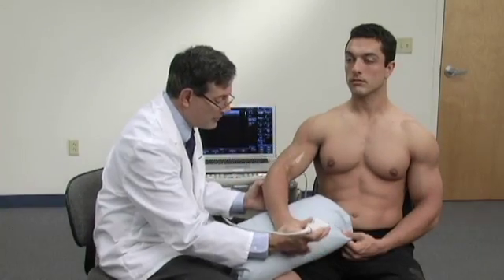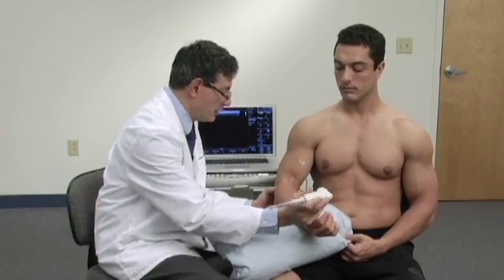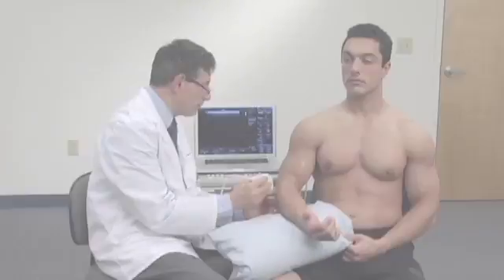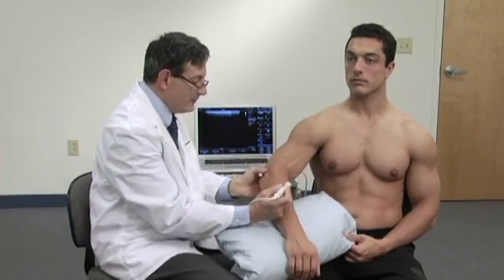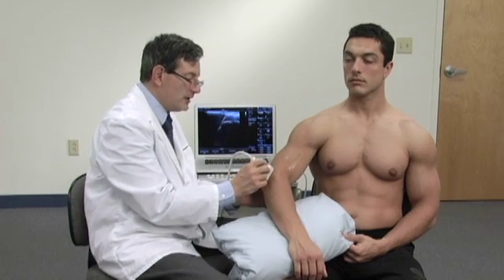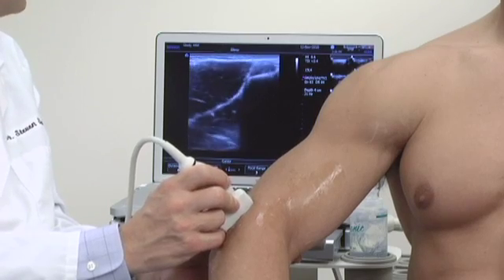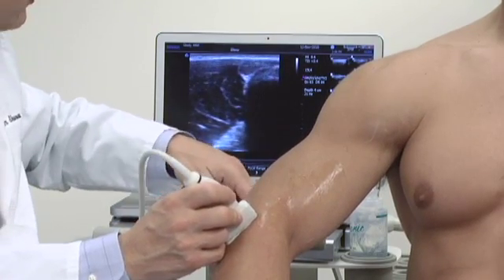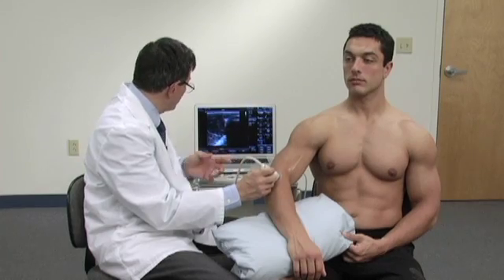Now let's say you relax your arm back up this way. Another alternative approach to looking at this tendon is to do this from the radial side of the arm. We can see his biceps clearly, and so what we'll do is align the probe along the length of the biceps tendon. We'll begin at the lateral epicondyle, then slide the probe forward. We want enough depth, and let's put the focal zone down because this is going to be a deep structure in this case.